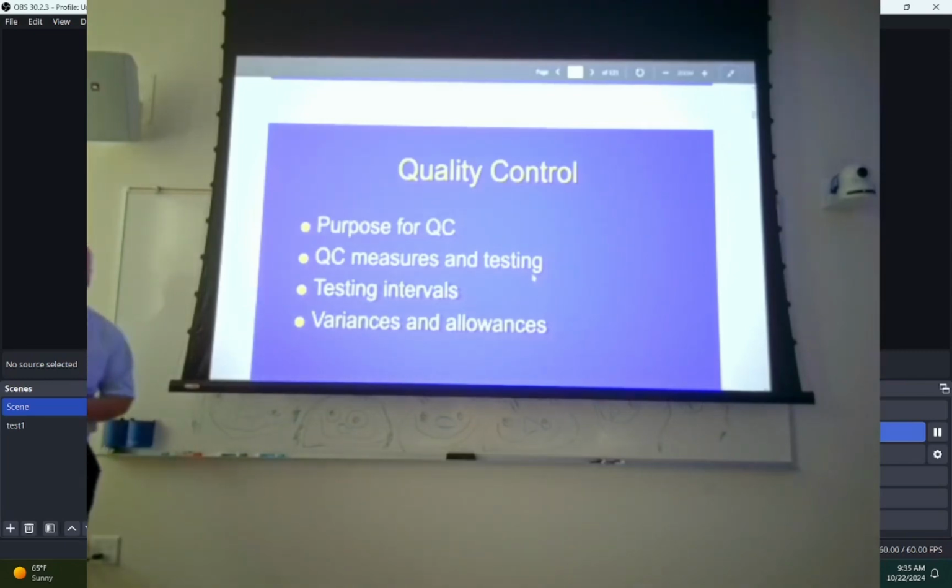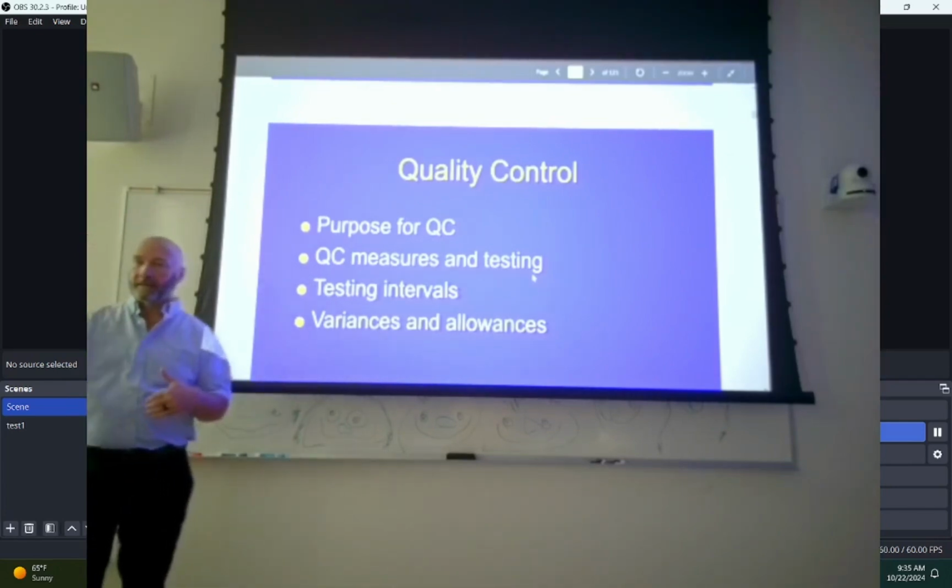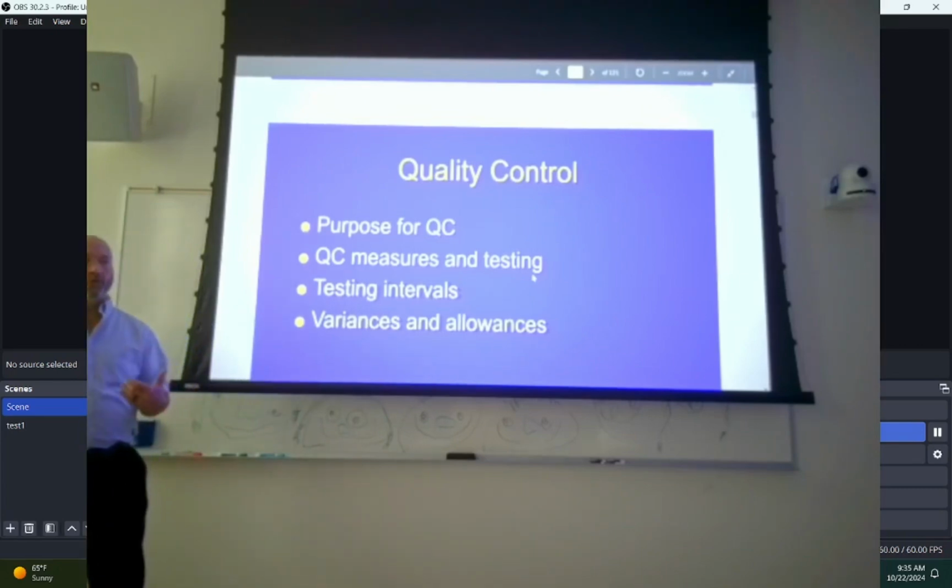For example, your collimated field, 40 inches, it can be off by a little bit more than an inch, so 0.8 inches. So it's 2% of the SID. Okay. So 2% of 40 inches is 0.8 inches. So your collimators can be off by about 0.8 inches. So what's your rule for collimation? How close do you collimate? Within an inch. Within an inch of the anatomy.